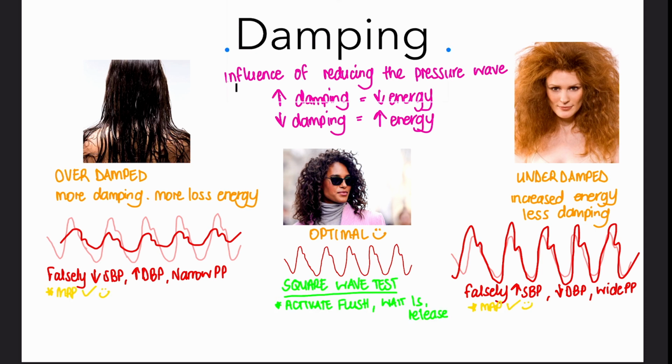So how do we assess this damping phenomenon? We need to do a square wave test. So we activate the flush, wait 1 second, and release.